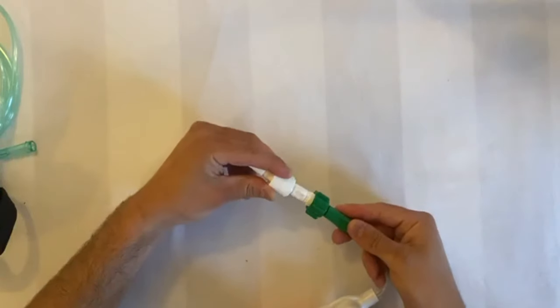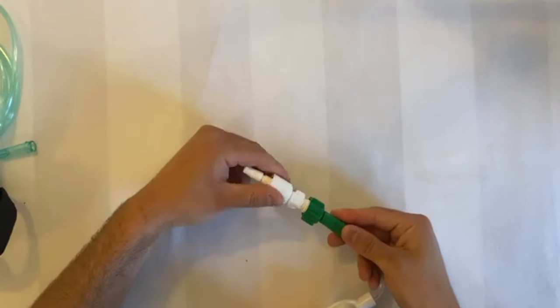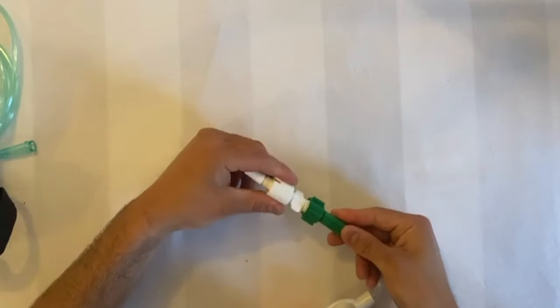The Schrader connector therefore needs to be attached to the kit before you begin therapy, which is done by screwing it into the end of the circuit as shown.